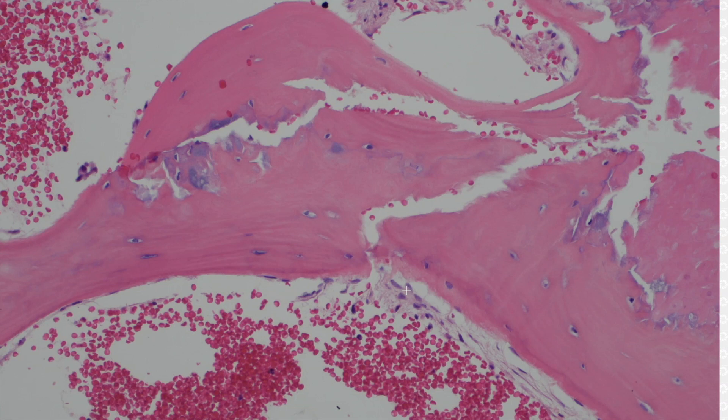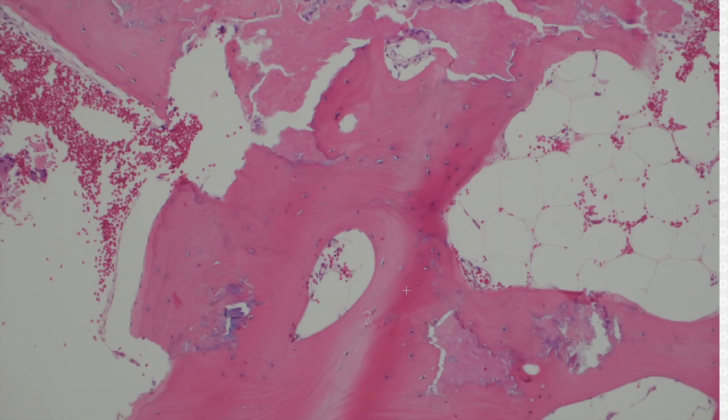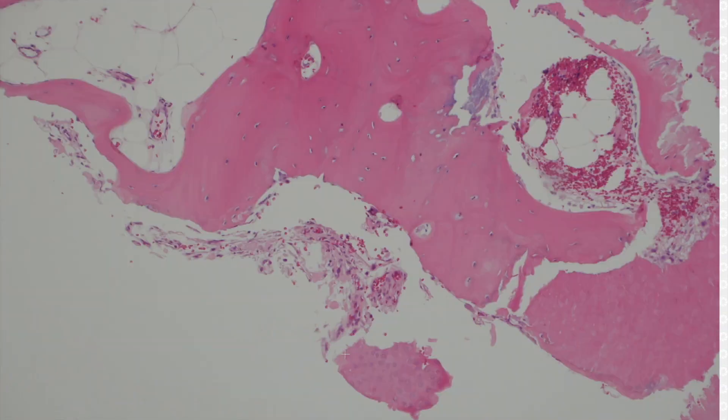And this pilar cyst has what in the middle of it? Bone formation. You can tell it's real bone because it's got lamellae. It's been around long enough — it's started to form into mature bone. It's got those nice lamellar concentric lines, and little lacunar spaces with tiny little cells — those are osteocytes living in their little lacunar space.